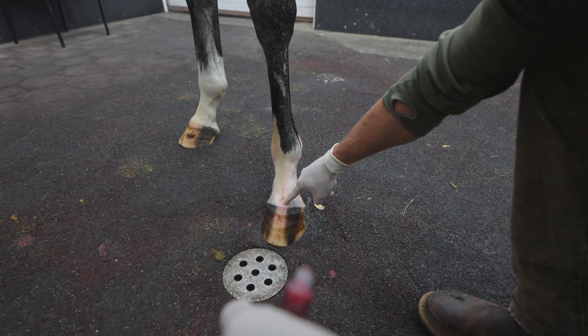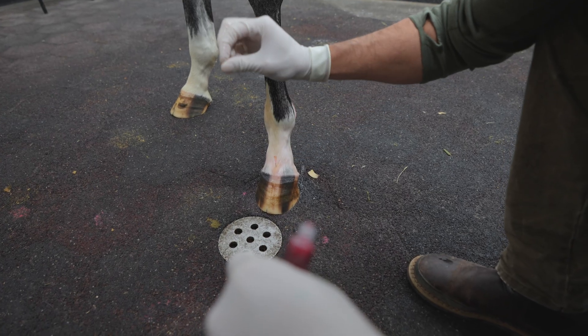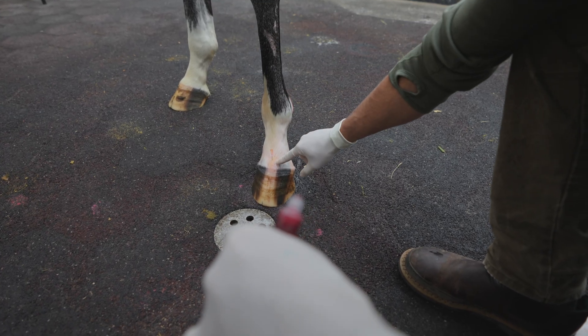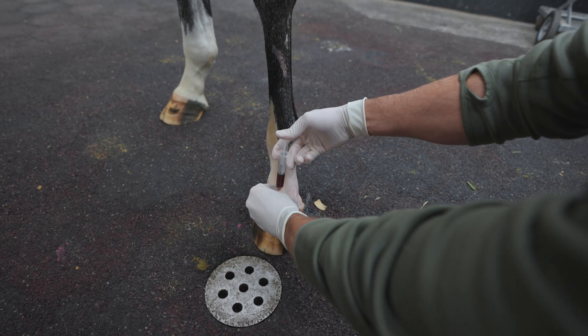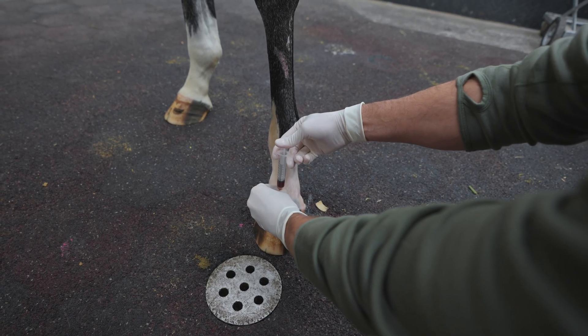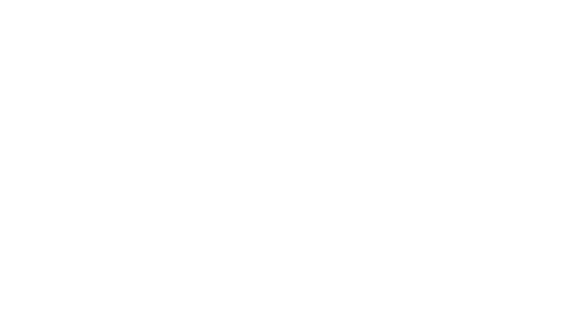We stick that into the coffin joint — we've got fluid there, though it's poor quality and super watery, which is why we're injecting this PRP. It flows nice and easy. There you have it.